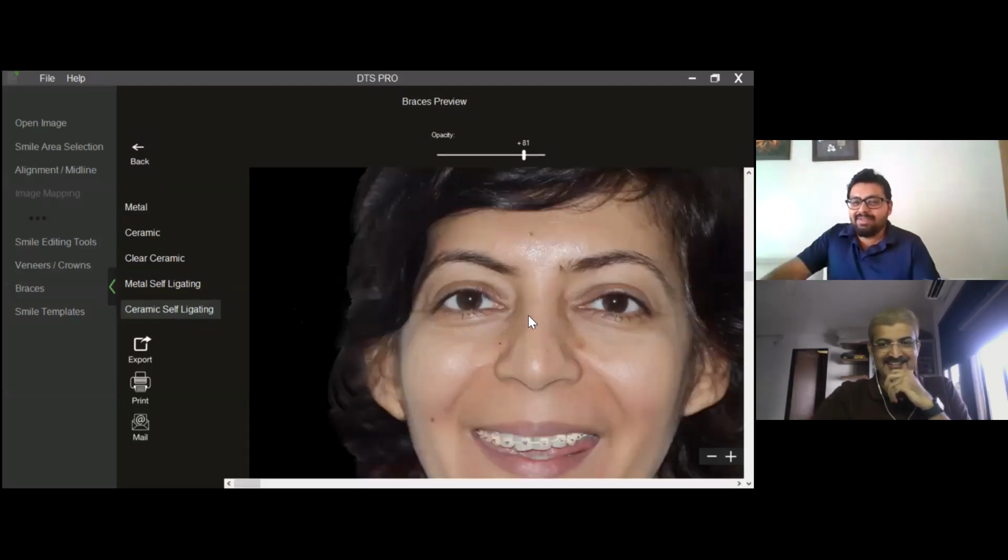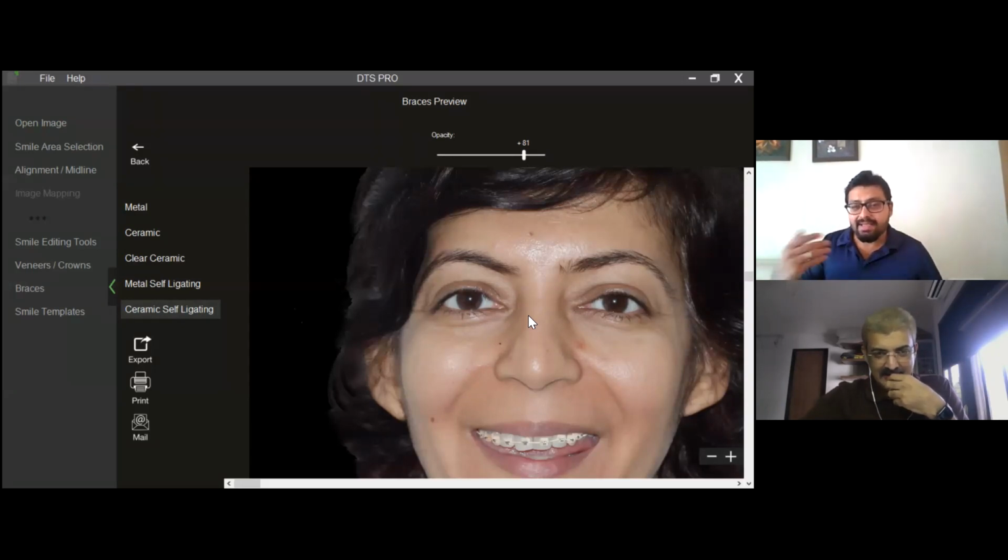Yeah, so we have lingual, there is always a requirement coming in for lingual and for Invisalign and for aligners, right? The thing is, for aligners, you have to simulate as if there's some plastic on the teeth, which looks really funny. So we have not. Anyways, it is the same as what you are wearing. Absolutely, same for lingual as well, right? So, any more questions?